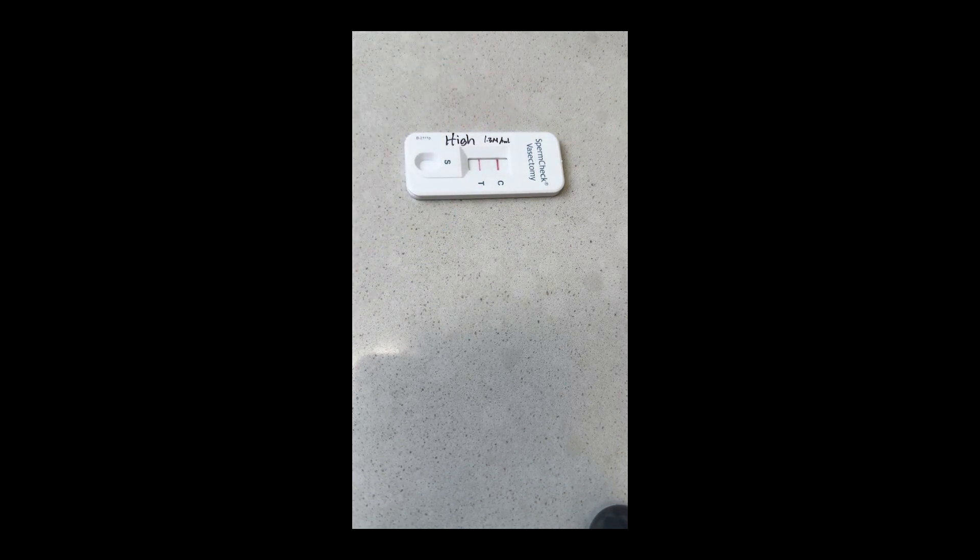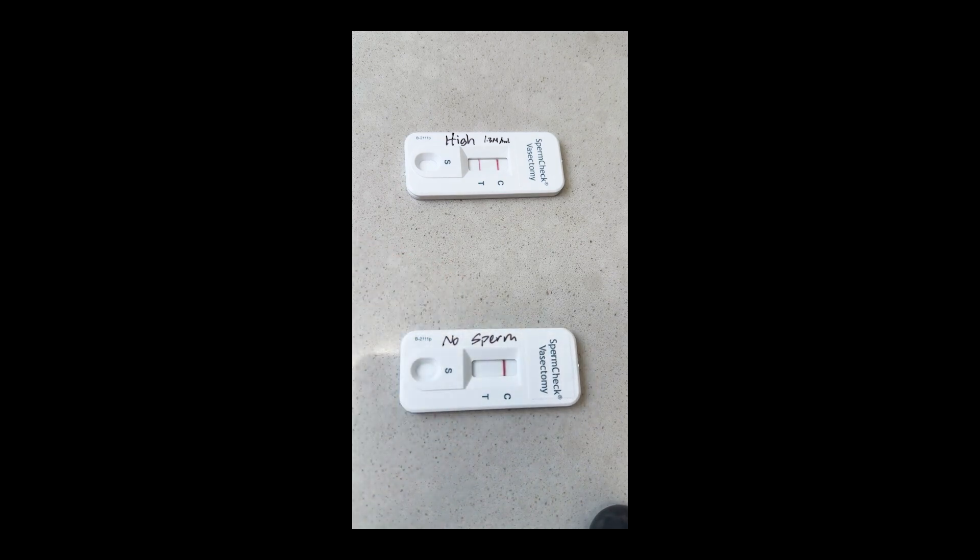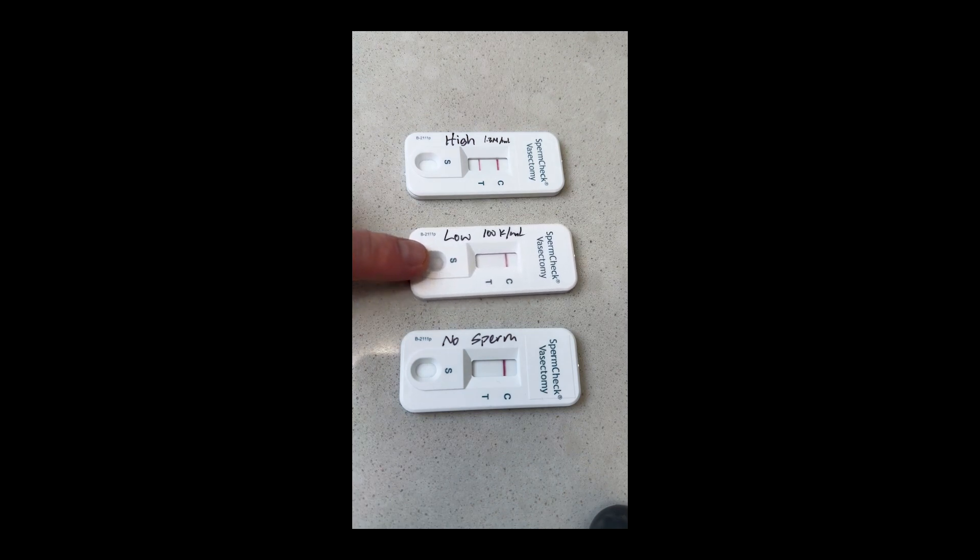Let's look at the results. Our high concentration came back with two lines as anticipated, because it's over 250,000 sperm per milliliter. The no-sperm sample has one line — less than 250,000. Our low sample also has one line. And that's the big problem: this test is unable to tell you if you have zero sperm or 100,000 sperm per milliliter.